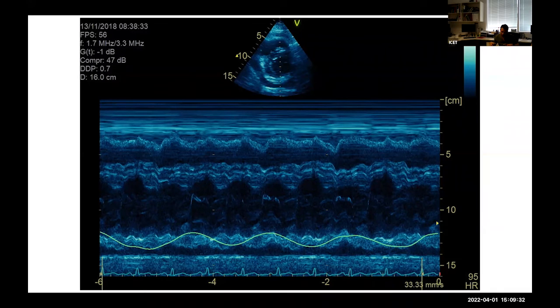opening up the size of your thoracic cage. Does that, with increased negative intrathoracic pressure, allow your pericardium to go out a bit more? You've got that negative pressure, therefore you get a bigger... Not if you've got constriction. If your pericardium's constricted, you don't get transmission of the intrathoracic pressures into the heart quite so much, because you're limited by that constriction.